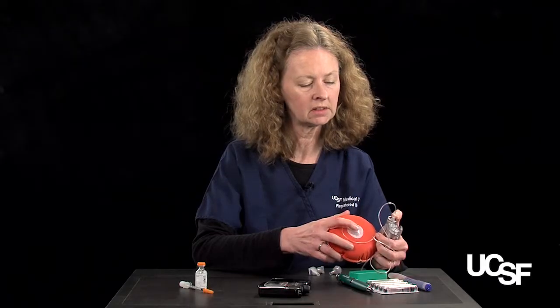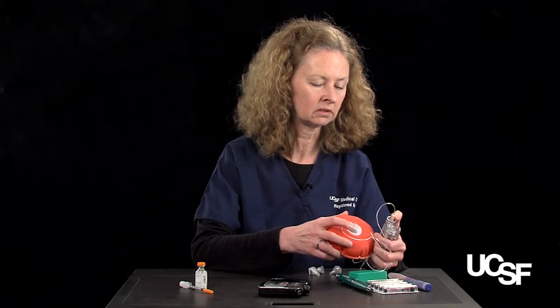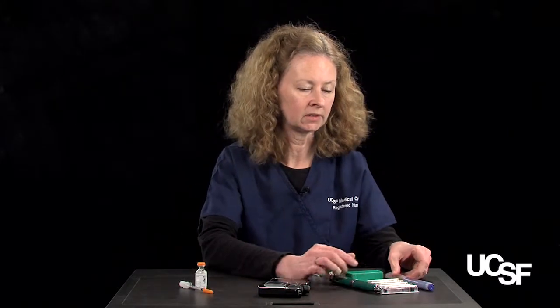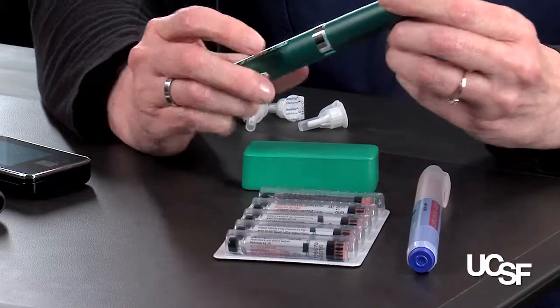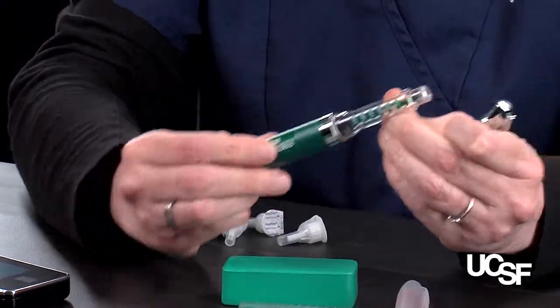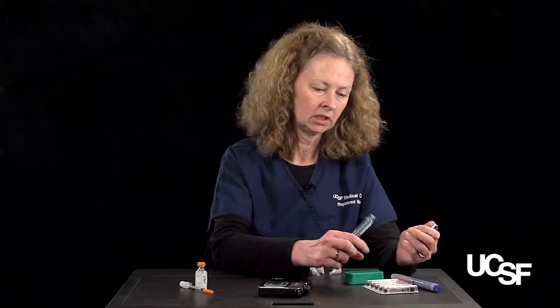So every 3 days, that system is changed out and a new set of insulin and insulin set are put in. So now we're going to look at the insulin pens. There are a couple of different insulin pens. Some are durable, where the cartridge is disposed of, but the pen is not, and the others are disposable. So let's look at the durable pen first.